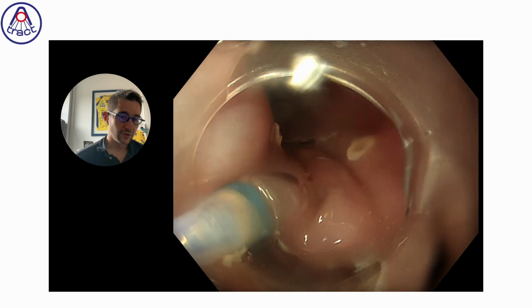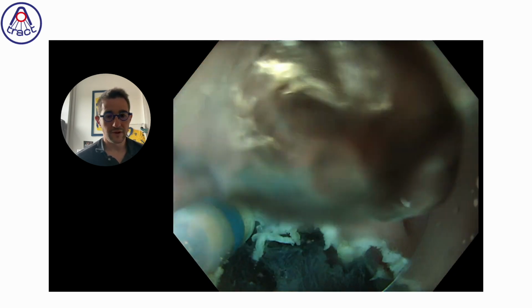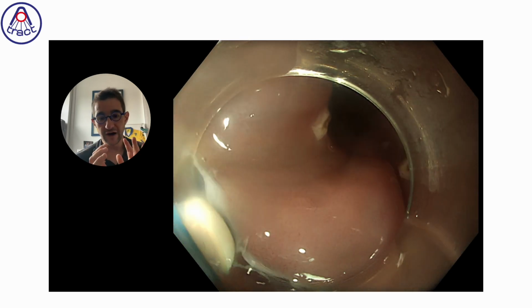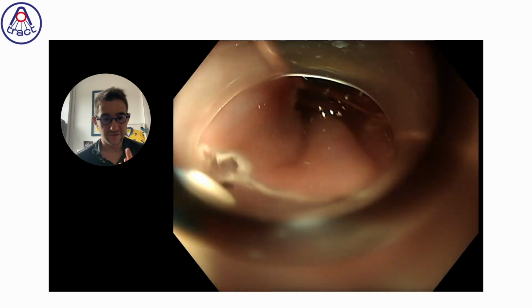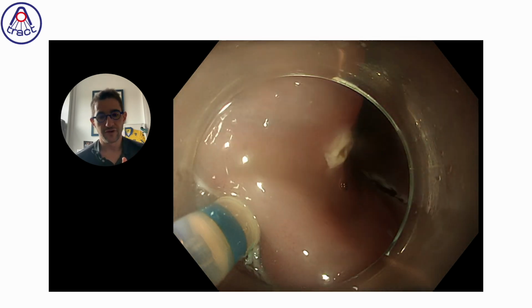So here you can see that he took the hand, so we can see that he works a little more far, and it's a little more difficult to keep the good axis. It's a lot of training to be sure of this.